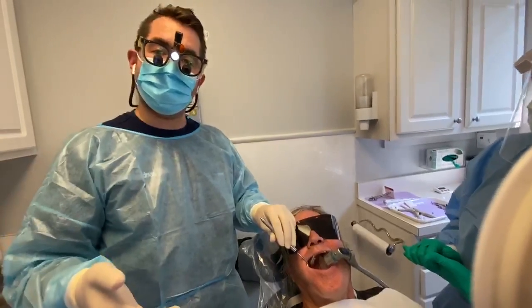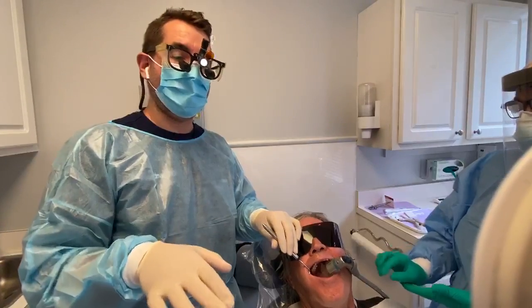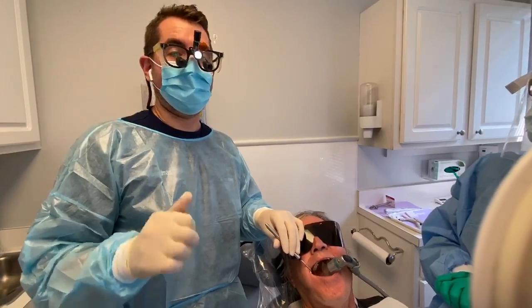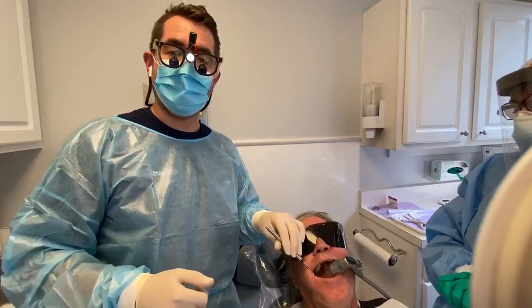It sounds too good to be true, but it's not — it's the Isolite. To find out more about it, just reach out to us at dentalnachos.com or text Isolite to 215-543-6454 and you can get your own dentistry best friend.